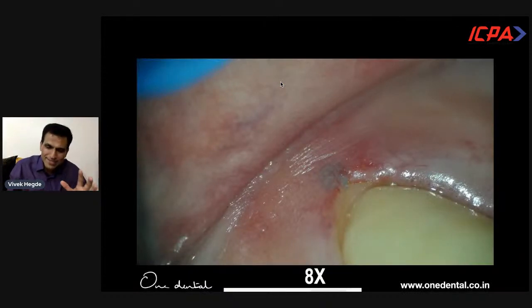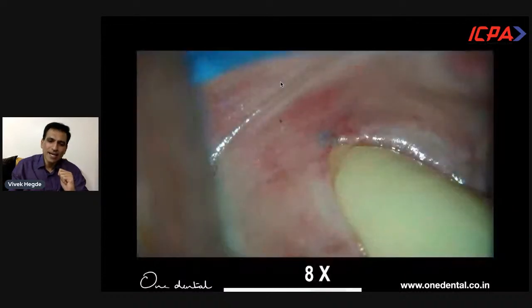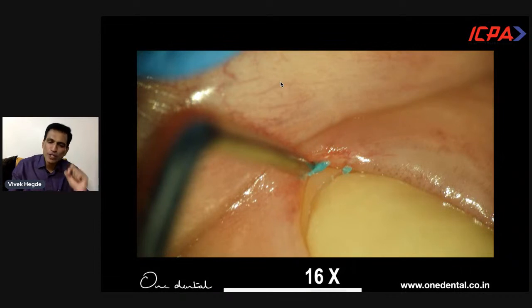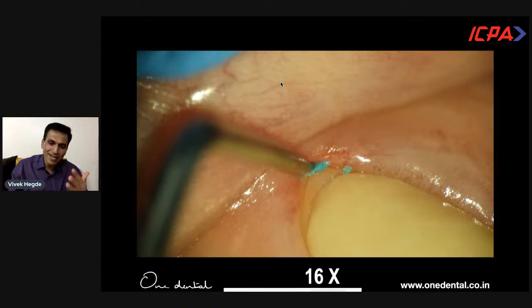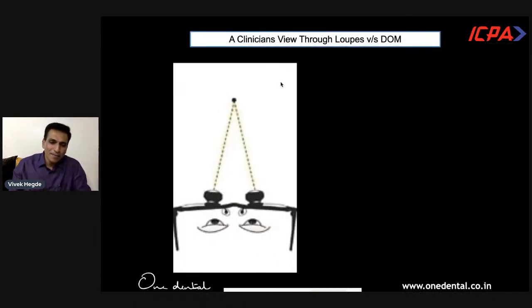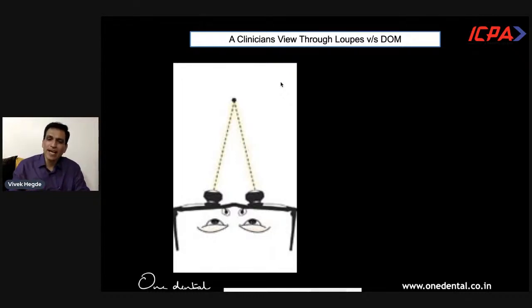The retraction cord is placed so nicely and smoothly with well-defined margins. One of the best compliments I receive now is that my labs are happy with my finish lines. With high magnification you can see exactly what you're doing — I pack the cord with hardly any bleeding because I'm tucking it precisely without excess pressure. In another example, a veneer placed by another dentist showed a greenish-bluish discoloration at the gingiva — at 8x I discovered it was elastomeric impression material left behind, which caused gingival recession.